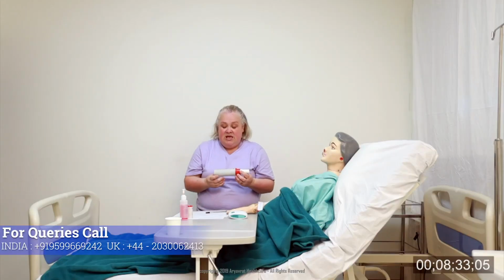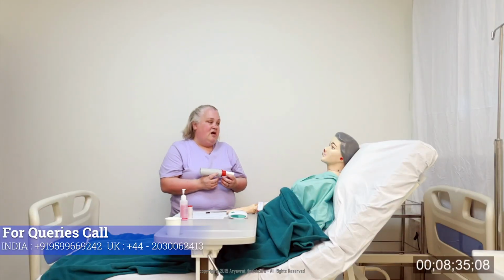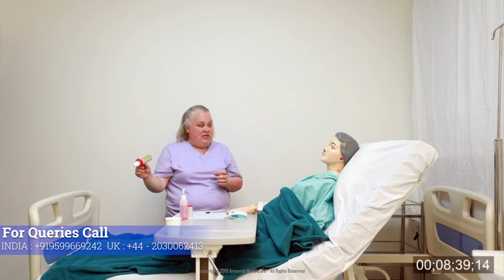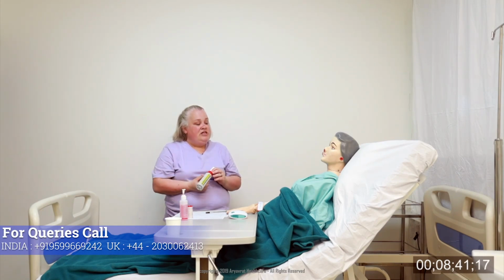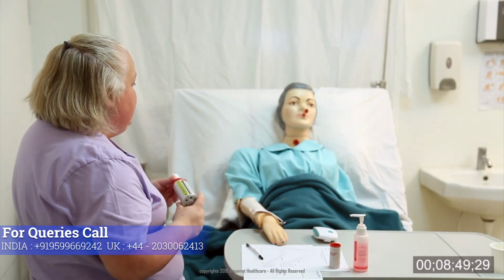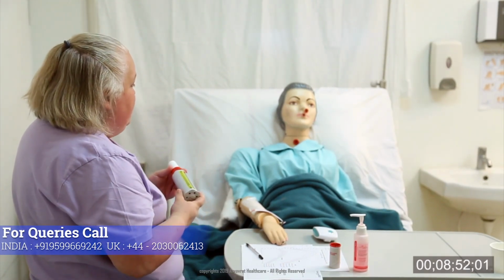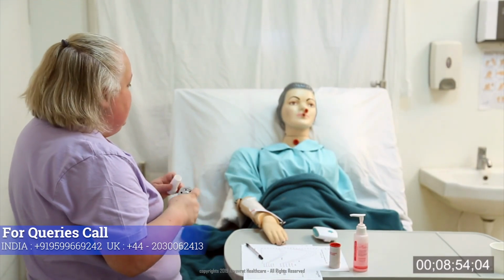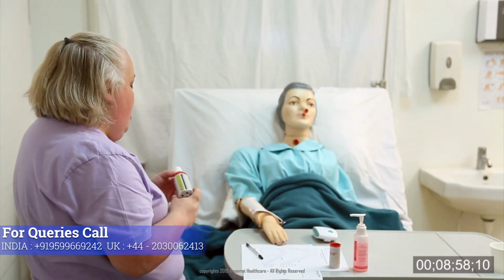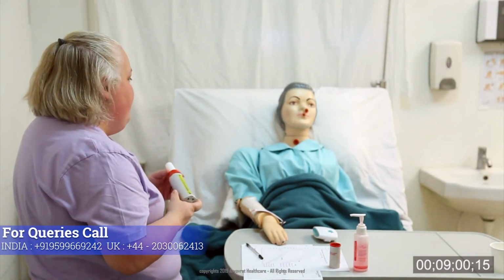Okay. And then at the end of 12 months, so after a year, you need to discard it. Okay. And your GP will be able to arrange a replacement for you. Oh, that's okay. All right, so don't let anyone else use it. It will be your own device. And make sure that you do wash it, clean it after every use, and sterilise it every 30 uses, and then that will keep it working properly for you.